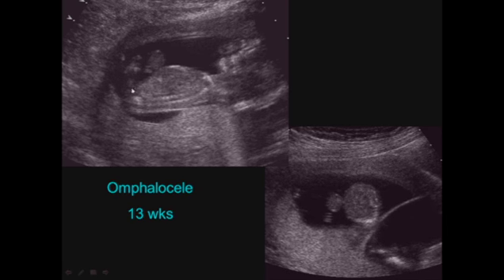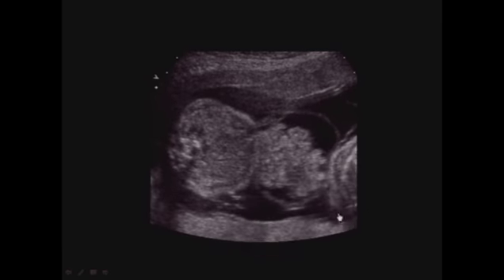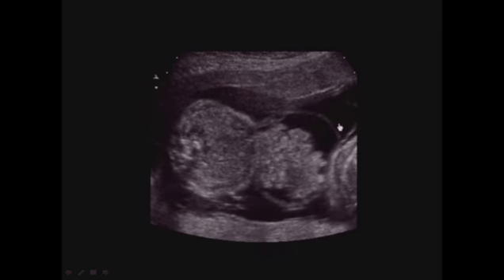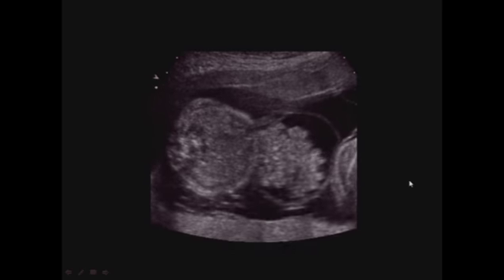Here's an omphalocele that was seen as early as 13 weeks. It's a profile sagittal view of the fetus, and you can see this little tiny thing sticking out right here in the anterior abdominal wall, and here it is on the transverse view, and this was a dichorionic twin gestation, and the upper twin has the omphalocele. Another example of an omphalocele, in this instance with just bowel in it instead of just liver in it, and you can see the covering membrane and the umbilical cord inserting just into the side here.